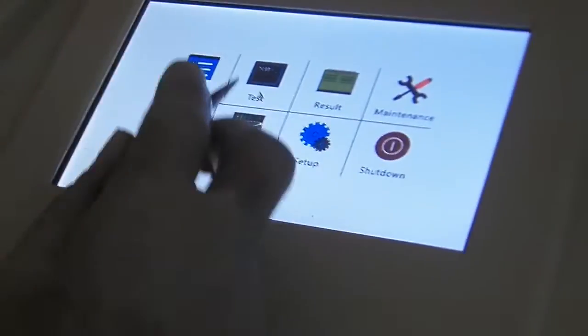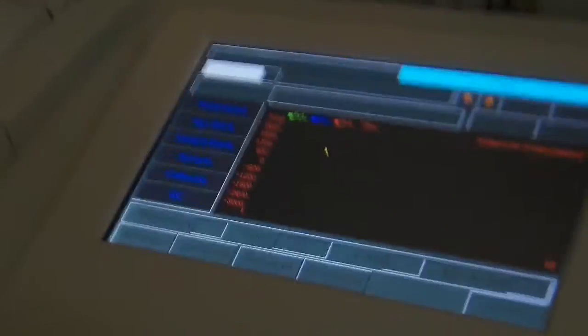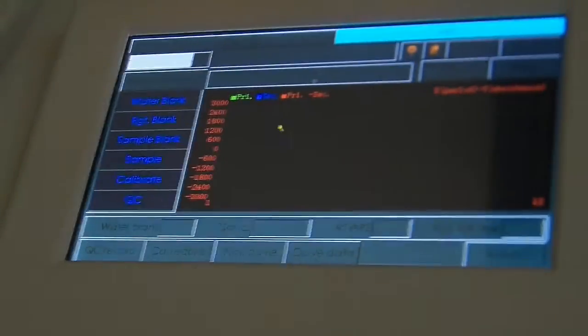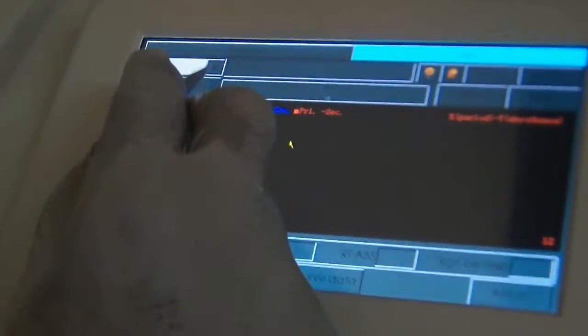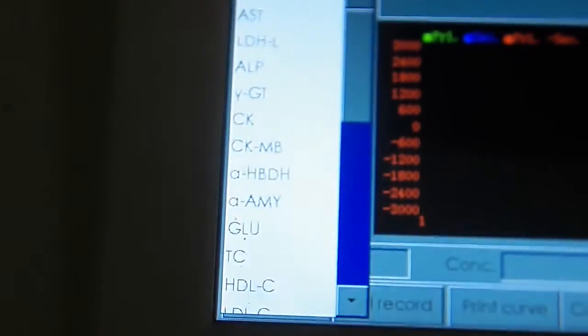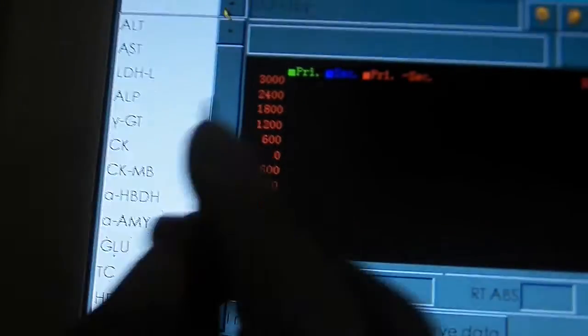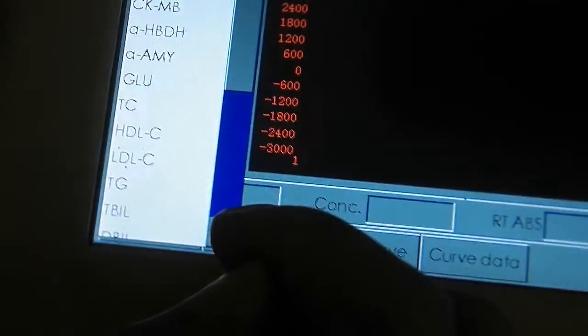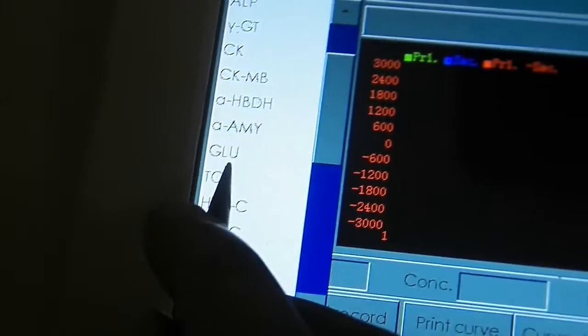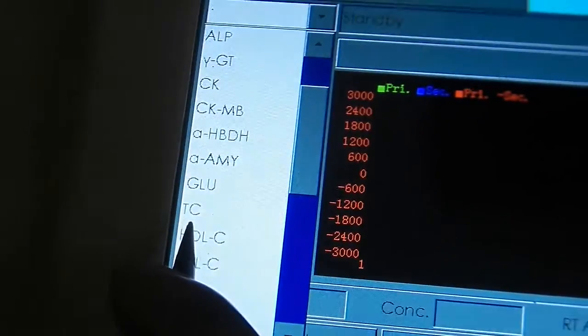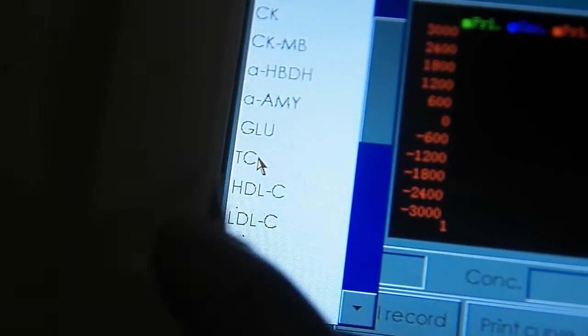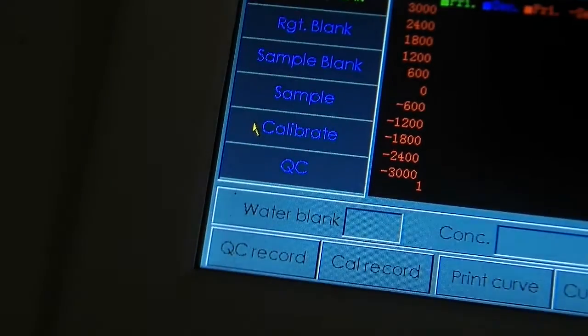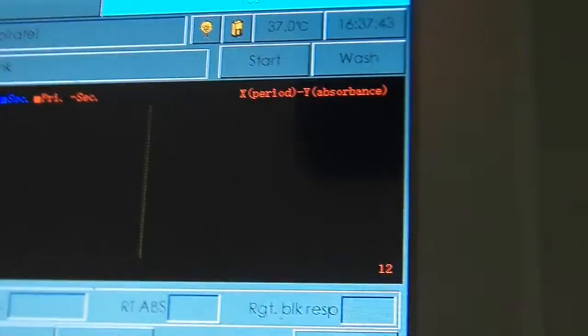So this is ready for testing. So how do you test? You come to the machine. You go to test. You select test. And then, first thing you have to do is you have to select the parameter that you're going to use. I don't know if you can get a clear view on that. So we're looking for total cholesterol. It is noted as TC on this machine. So we select TC.